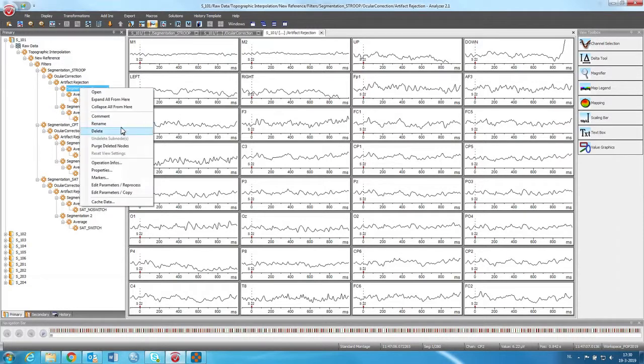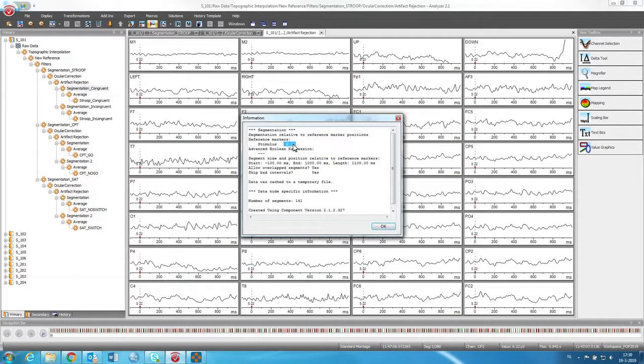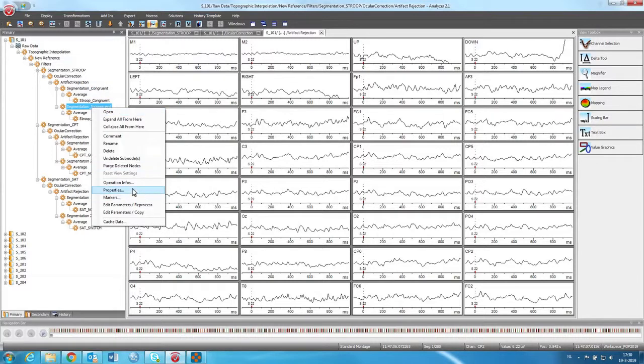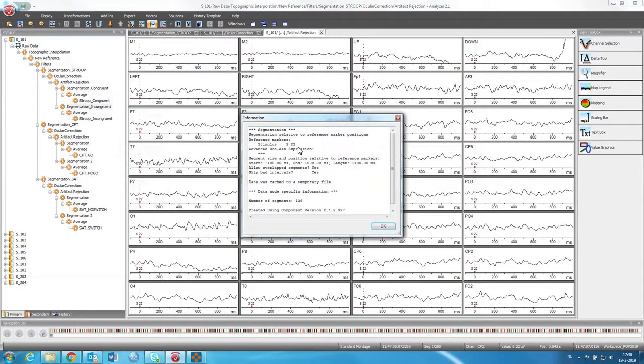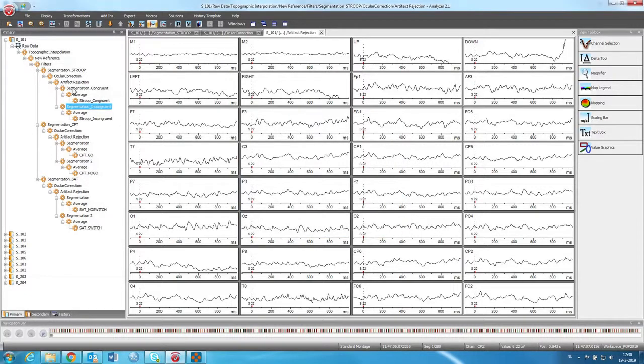And this segmentation is done, as you can see, on stimulus S21. So 21 was the code for the congruent trials. And then we do this again for S22. And that was the incongruent trial. So then we have separate segmentation for the congruent and the incongruent.